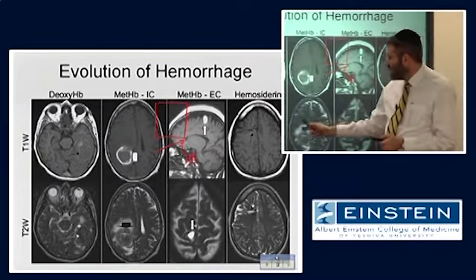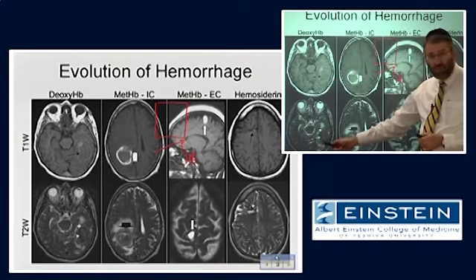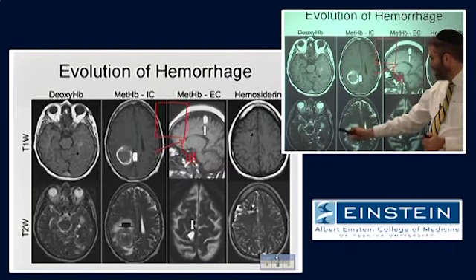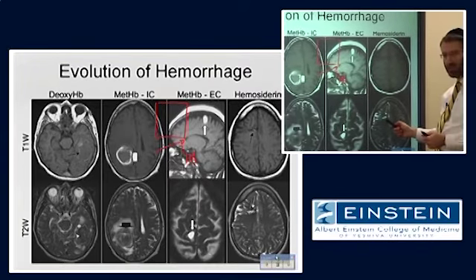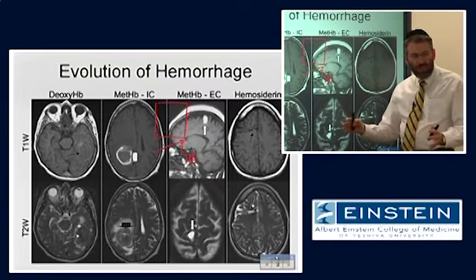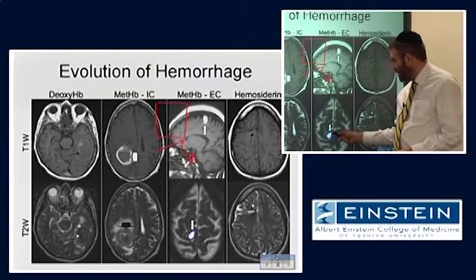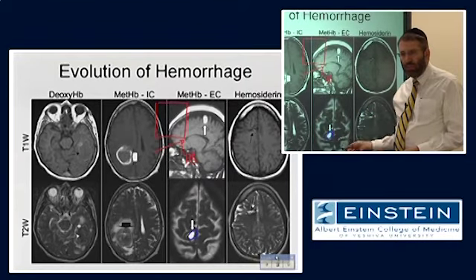And on the other hand, we have this prominent magnetic susceptibility effect on our T2 weighted image, whether it's deoxygenated hemoglobin, methemoglobin, or hemosiderin. It's all the same effect. The only difference is that in the case of extracellular methemoglobin, because there has been lysis of those red blood cells throughout the hematoma, there is no longer any gradient of magnetic susceptibility, so we don't see that signal loss.